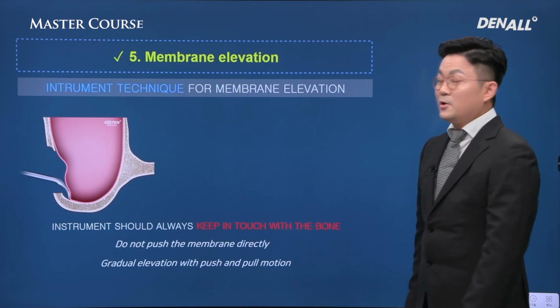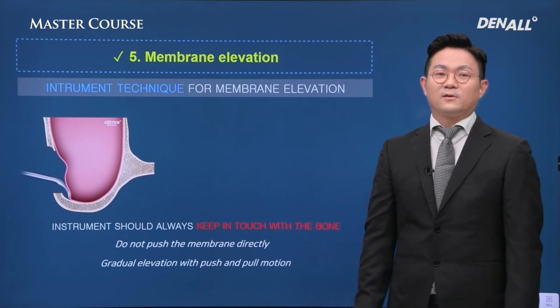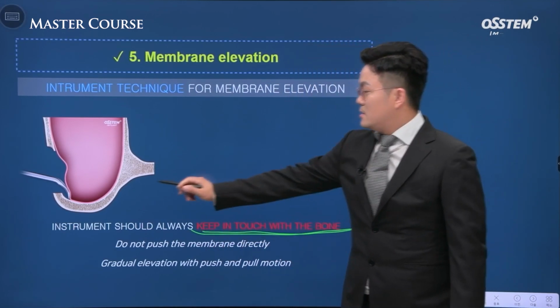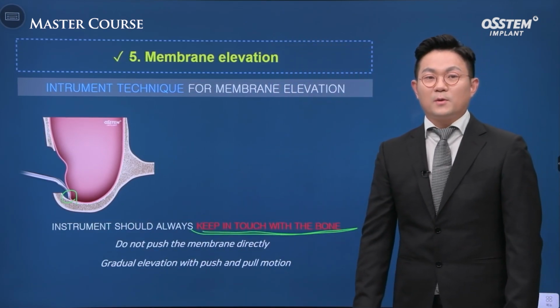So the important thing here is this instrument. If it's in the air, it should not be that way. Always it needs to be kept in touch. The edge side should always be in touch with the bone.